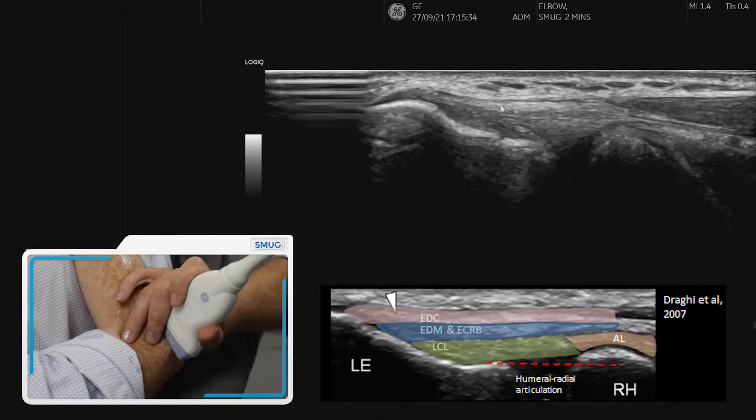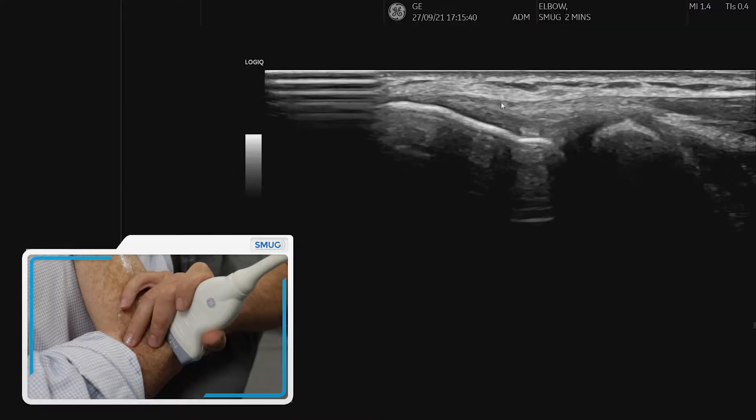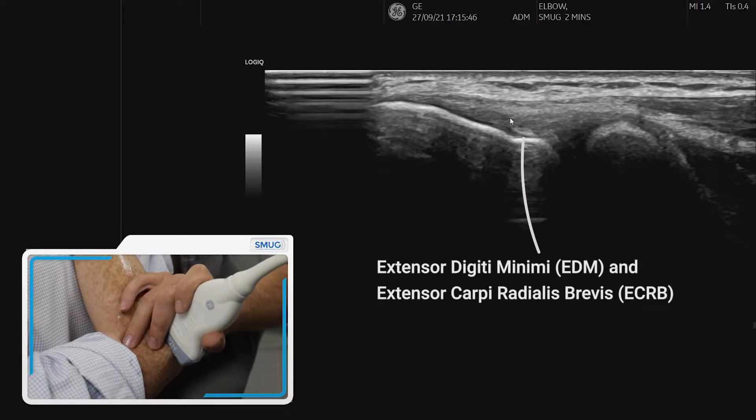When we do this view, there are three layers that we need to be aware of. The first layer at the top is the extensor digitorum tendon layer. Underneath that we have the EDM — extensor digiti minimi — and extensor carpi radialis brevis.